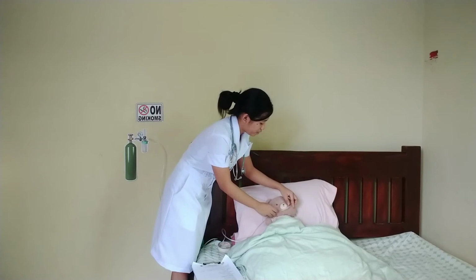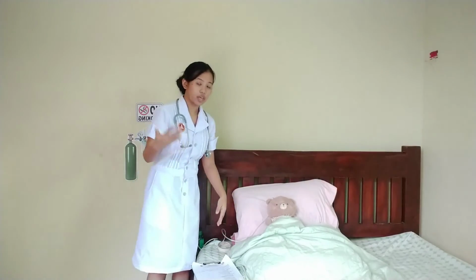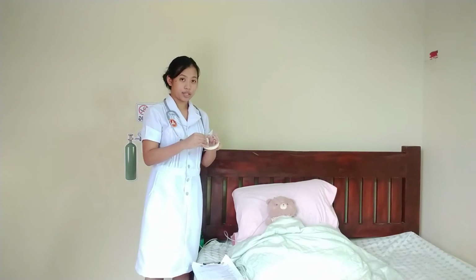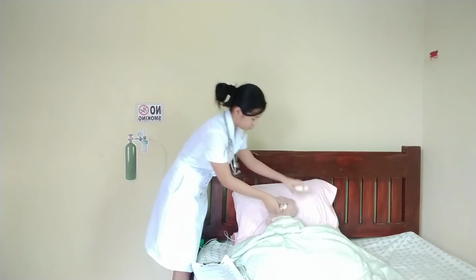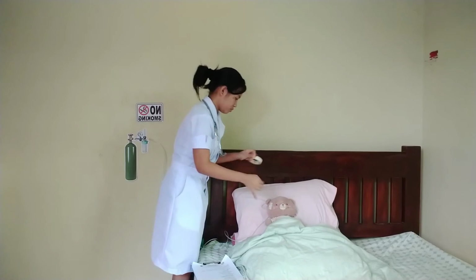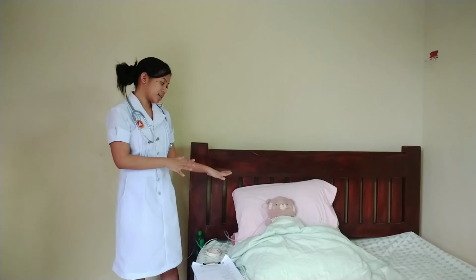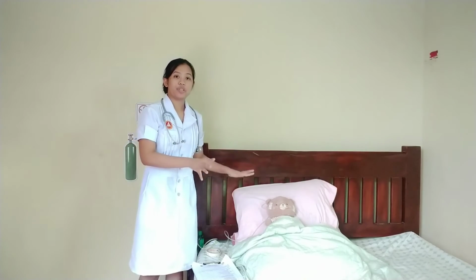And then if the nasal cannula or the tubing does not stay, I will use tape for it to be fixed. Right. Now the nasal cannula is within the client's nares, so the oxygen is already administered.